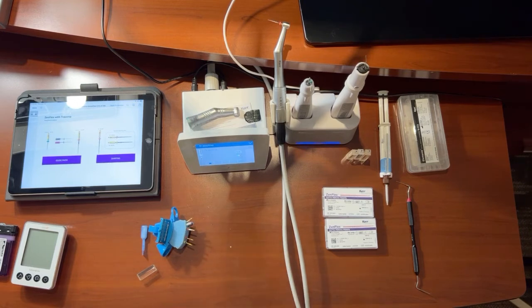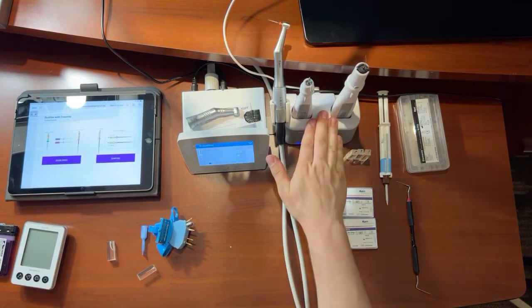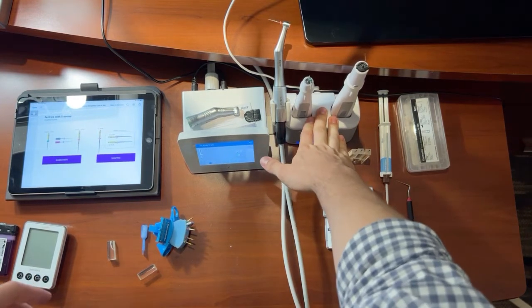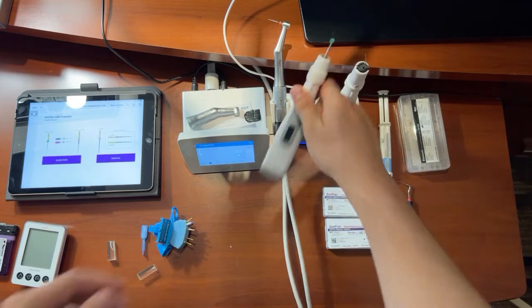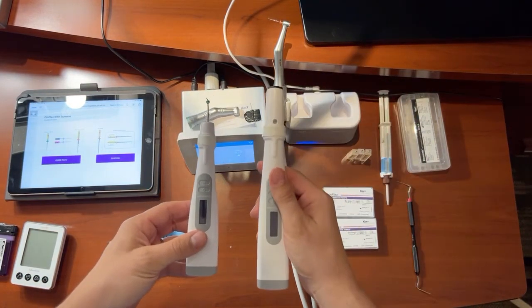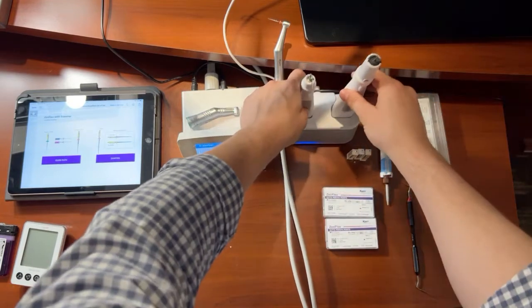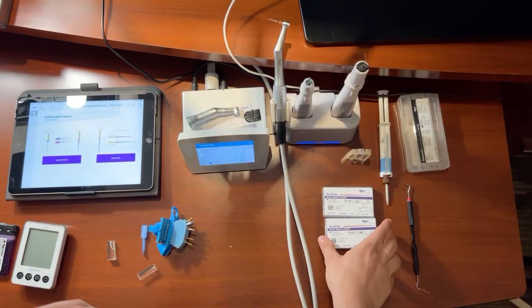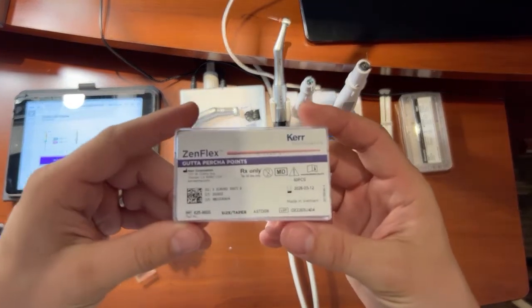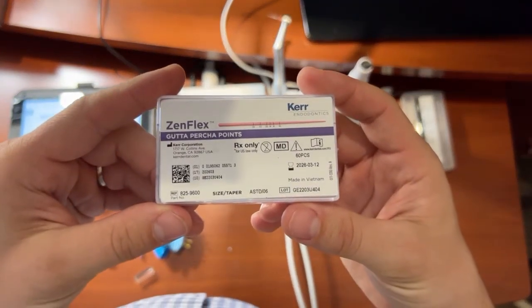So this is our obturation unit here. This is the Elements IC. Make sure you guys can see that. Perfect. So we have our down pack and our backfill. So super important here is to have matching gutta percha. So ZenFlex has a matching gutta percha cone.